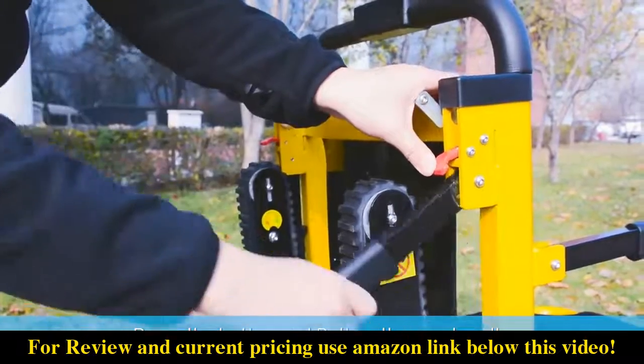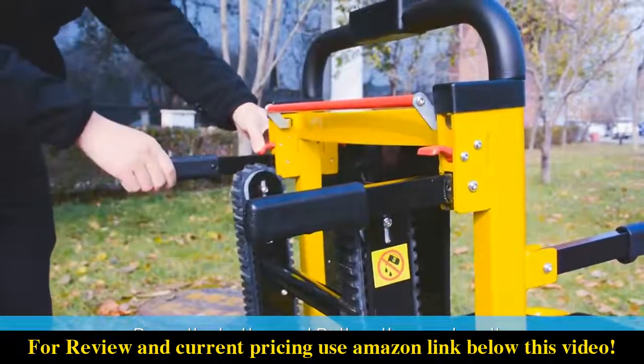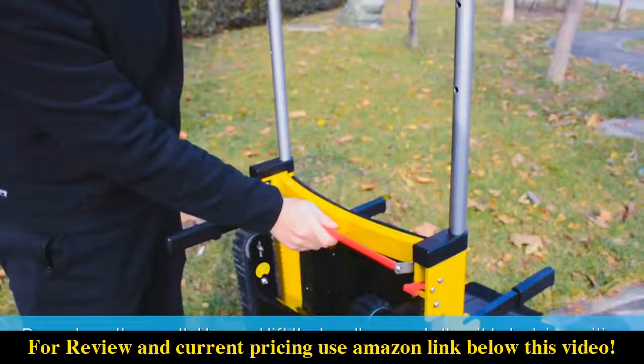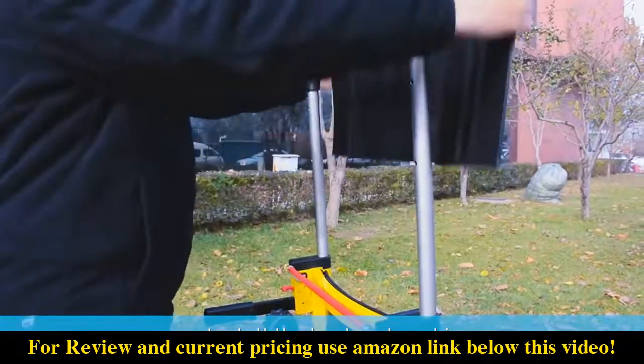Press the button and pull up the rear handle. Press down the parallel bar and lift the handle up and allow it to lock in position. Install the backrest cushion.